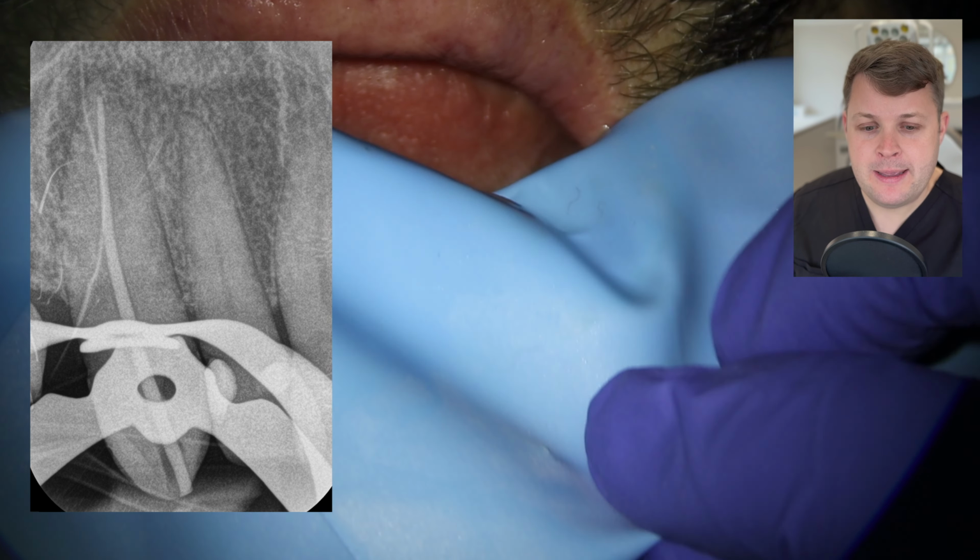We're going to set up this disinfecting ring. We're going to use our disinfecting ring to fill a well full of sodium hypochlorite. We're going to use a file to introduce the bioceramic later, and we're going to disinfect that. We're then going to pull out the GP cone and place that into our disinfection ring. And now those two instruments, the GP cone and the instrument, are getting nice and clean.